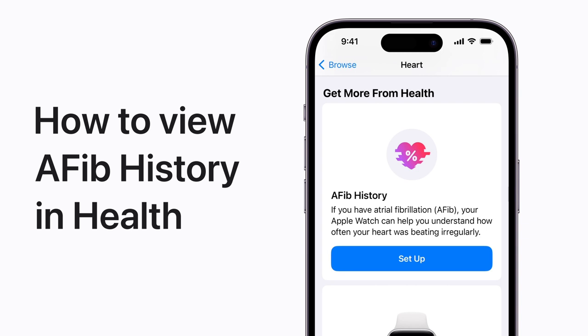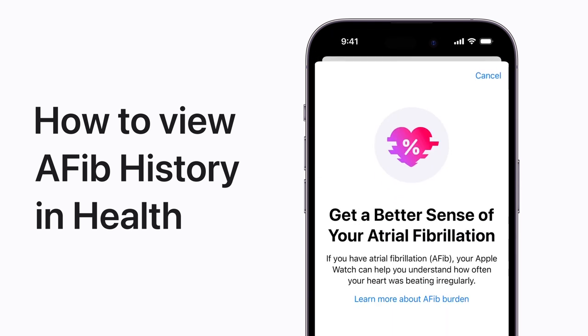If you've been diagnosed by a doctor with atrial fibrillation, you can turn on AFib History to see an estimate of how frequently your heart is in this arrhythmia.